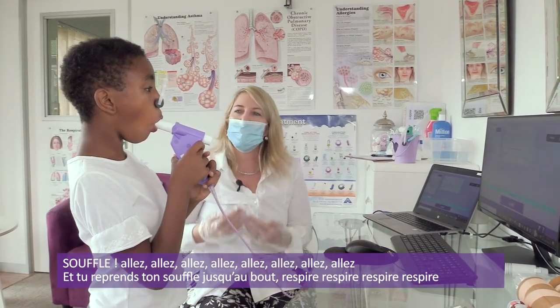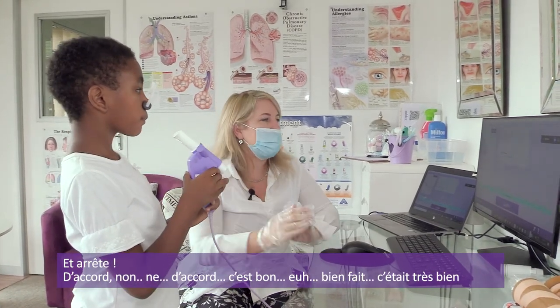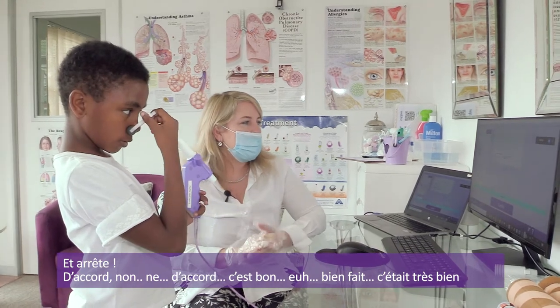Go. And breathe in all the way to the top. Breathe, breathe, breathe, breathe, breathe, breathe, and stop. Okay, that's fine. Well done. That was very nice.